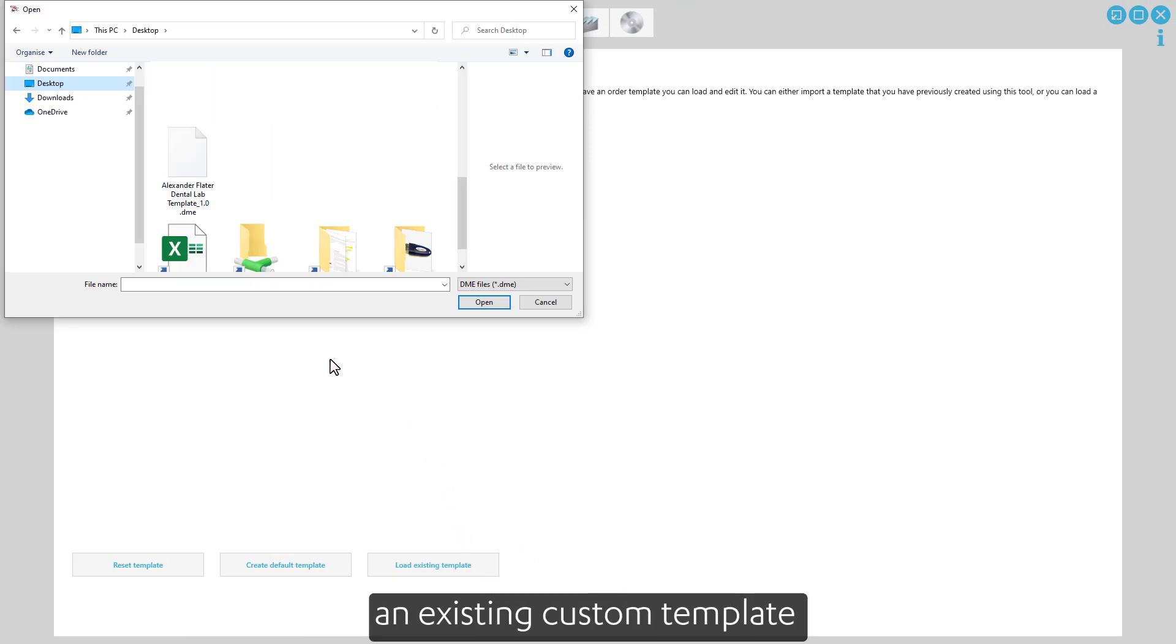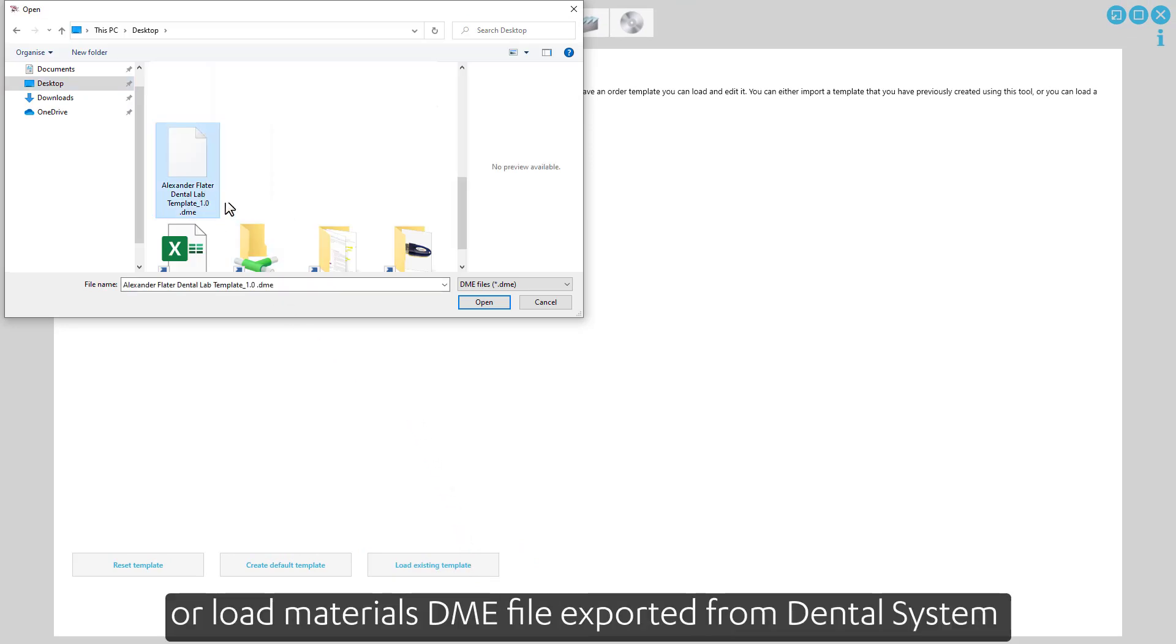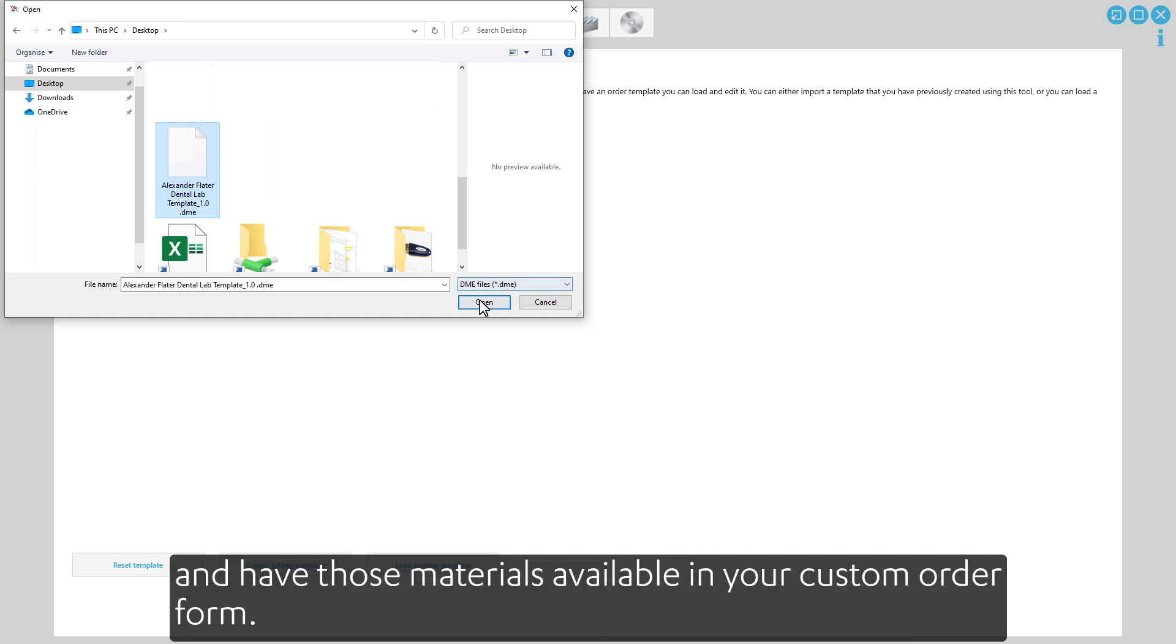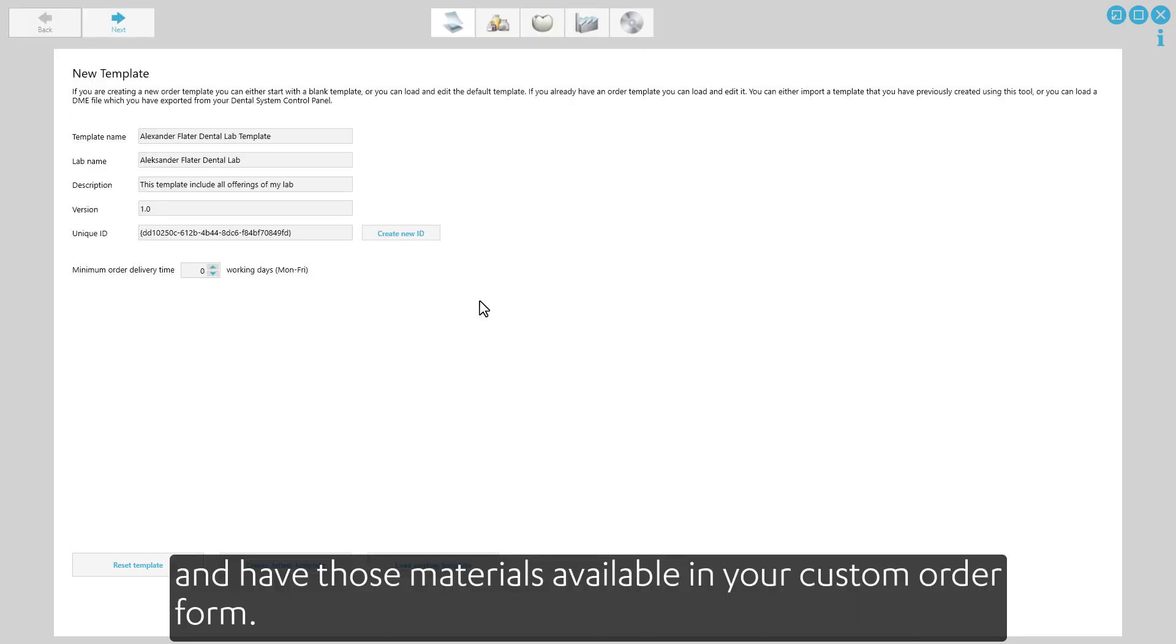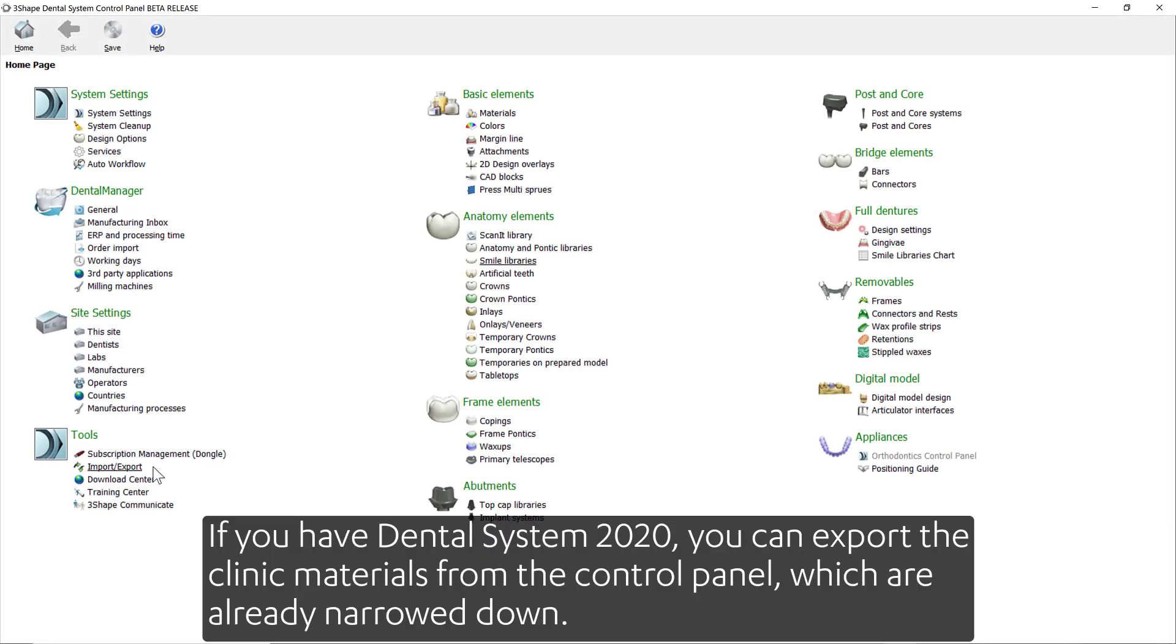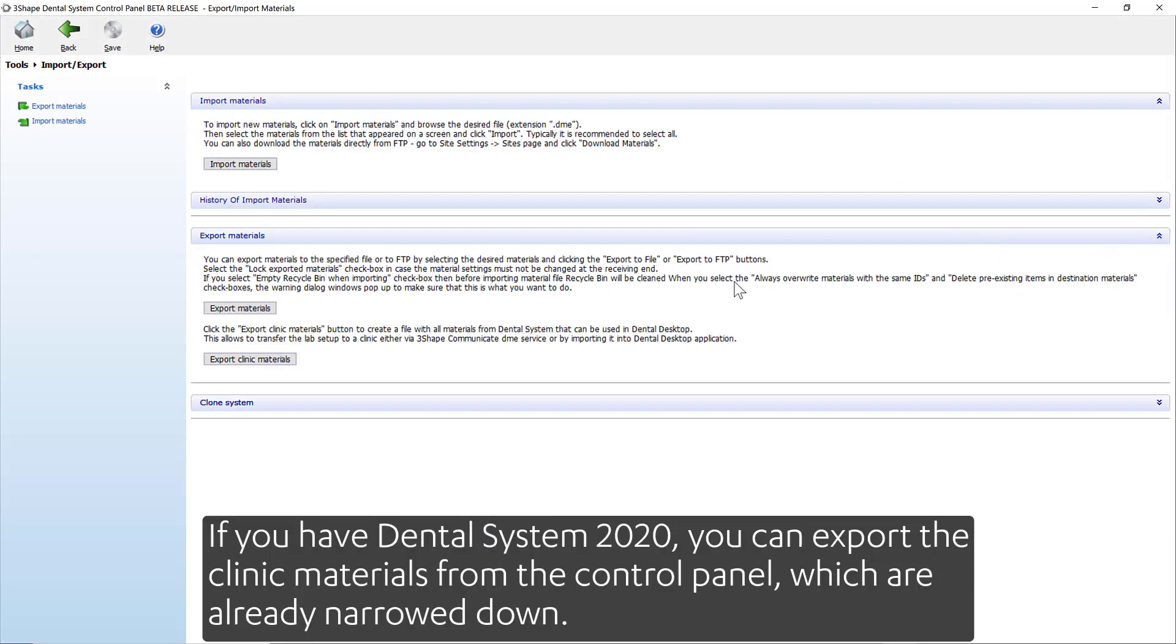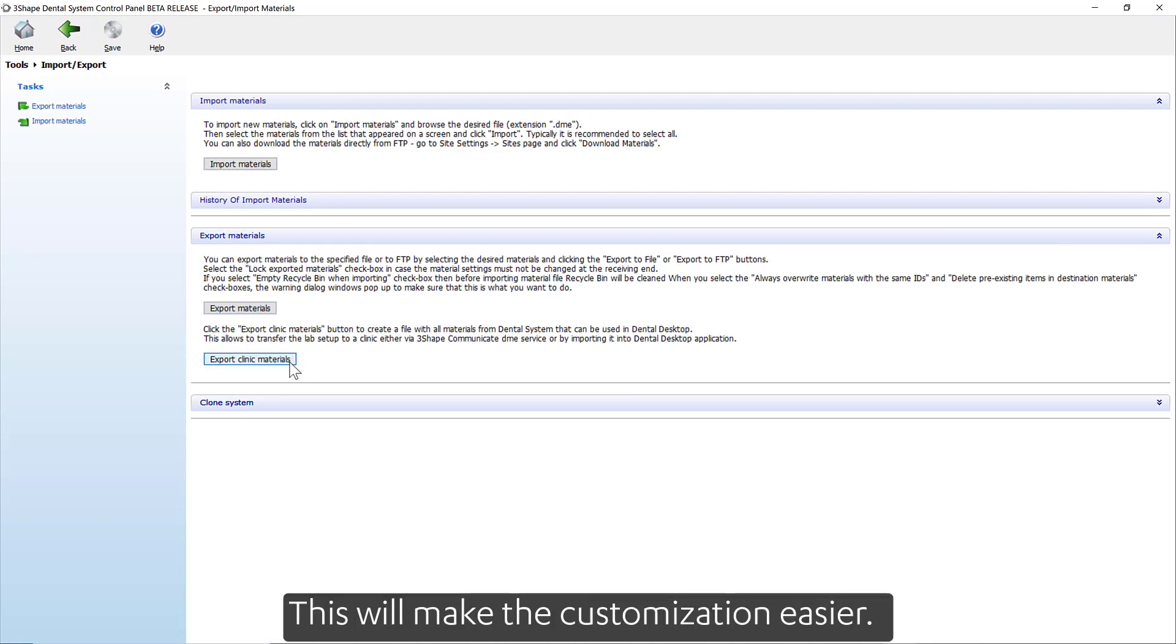The last option enables you to upload an existing custom template to update it, or load material DME files exported from Dental System and have those materials available in your custom order form. If you have Dental System 2020, you can export the clinic materials from the control panel, which are already narrowed down. This will make the customization easier.